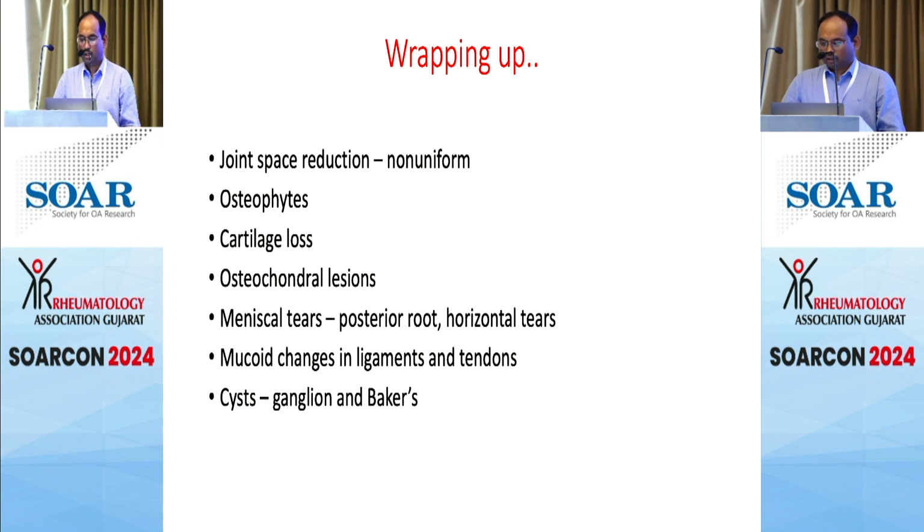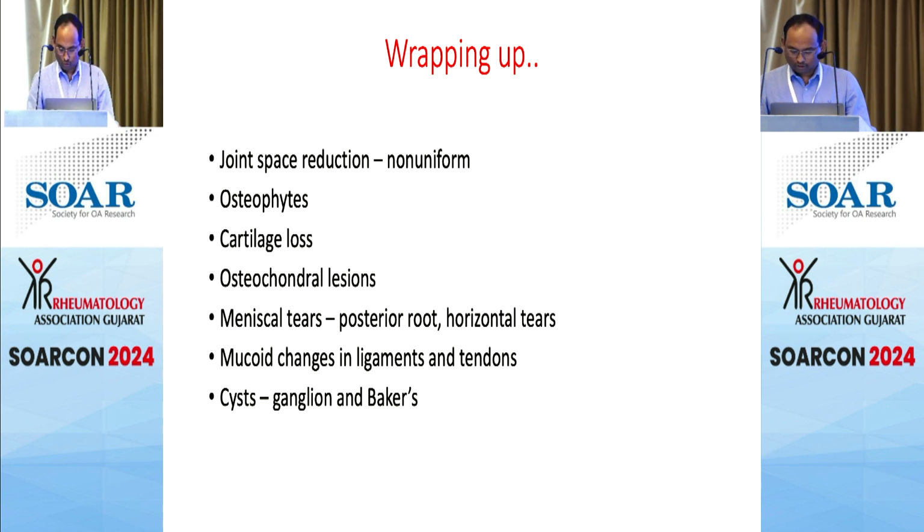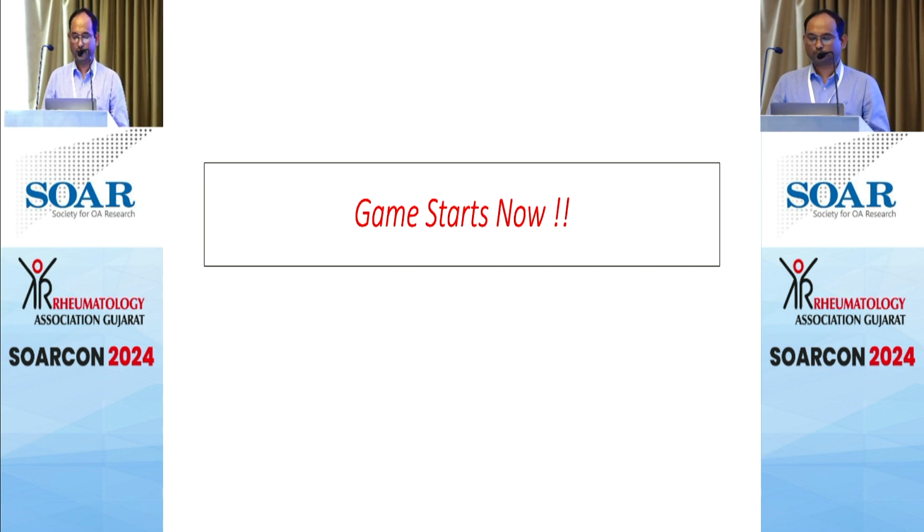the common cysts. Now we'll move on to the more interesting part, where I'm more interested in the interactive session, which is the case-based discussion. Let's see what we have learned from the last 10-15 minutes. This will be a poll-based session where I think all of you present here have downloaded the Slido app.